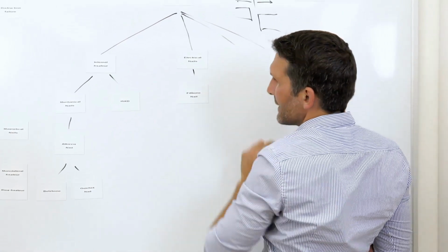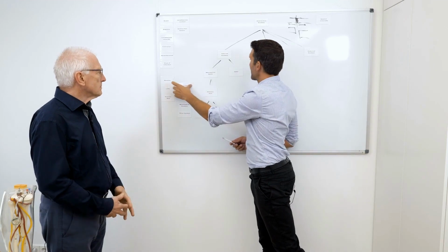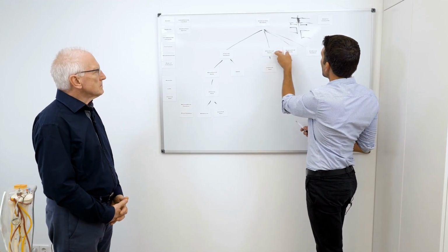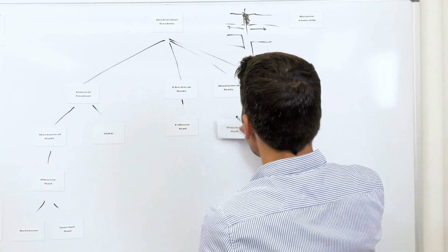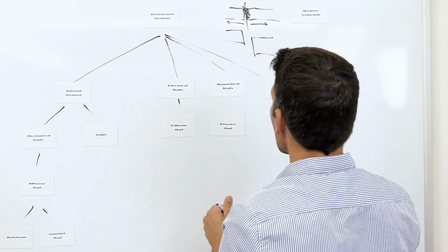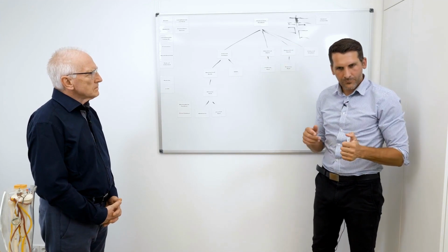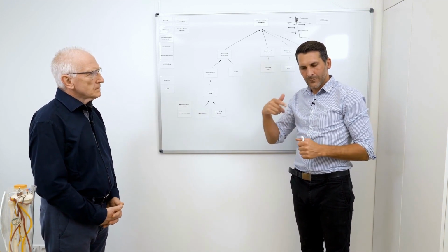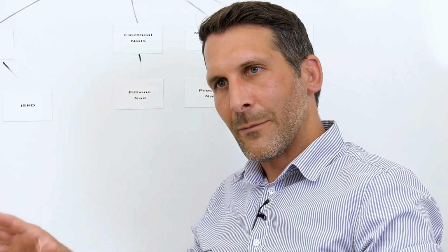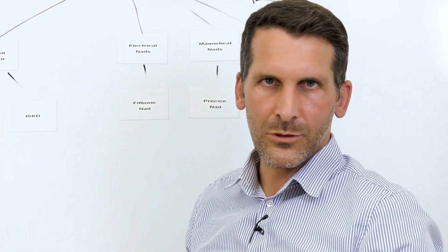So, now we have our third group, our magnetic nails, exactly. Magnetic nails, workhorse. Here, the Precice nail. With the Precice nail, it is like this. You have the drive mechanism, which is inside the nail, basically it's purely magnetic. And you have a module that you place outside of the body to drive, initiate, or stop this magnetic feed mechanism.